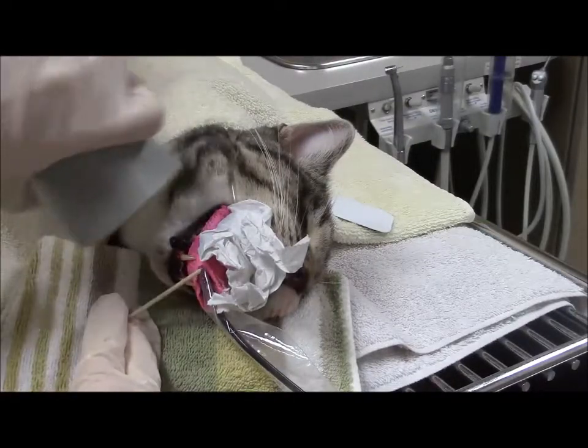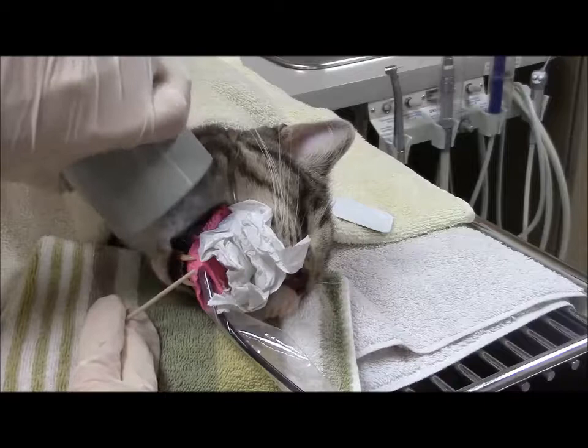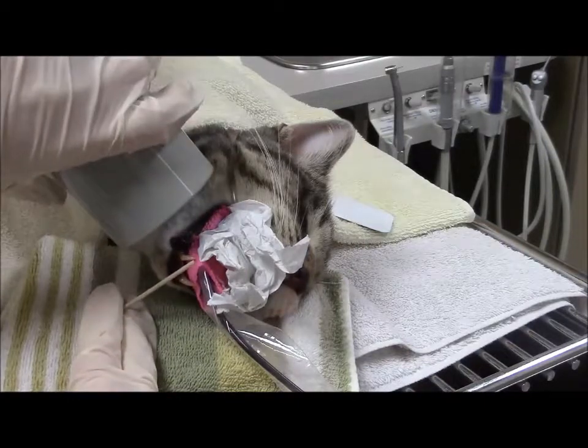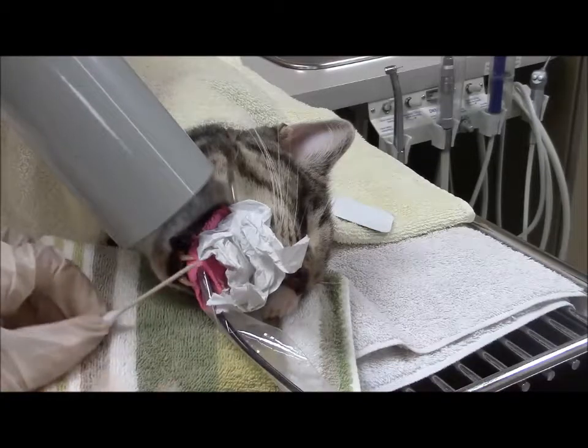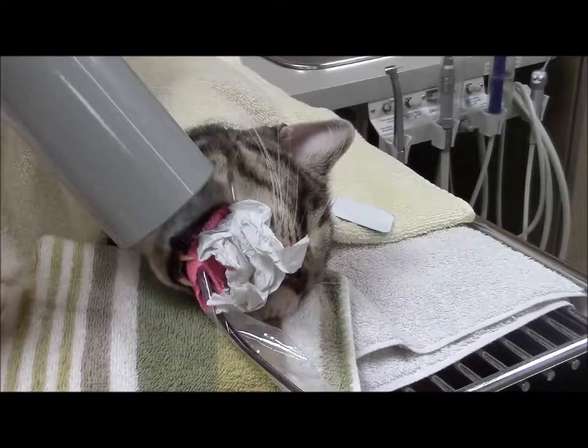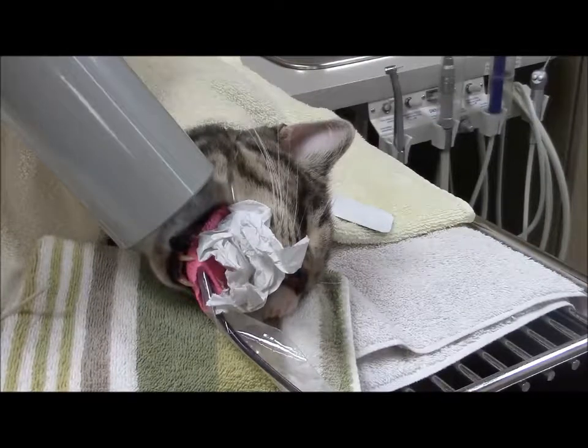So what I'm going to do is take my cone, and I'm going to pretend that there's crosshairs and a collimator light, and I'm centered right in the area that I want, but you can see that I'm aimed right at my bisecting angle. Okay, so again, bird's eye view for any premolar tooth is at the front of the mouth.